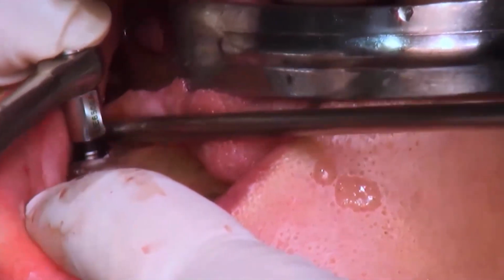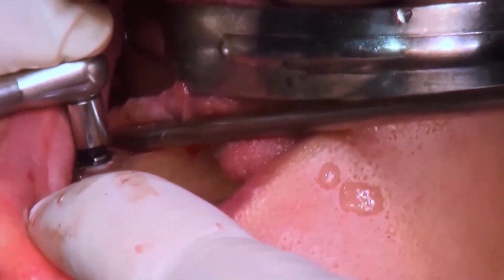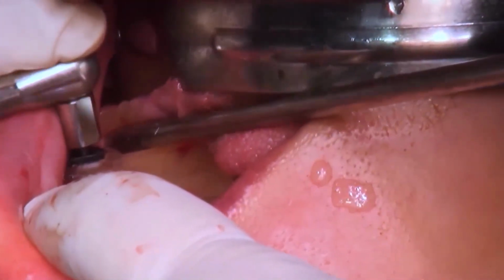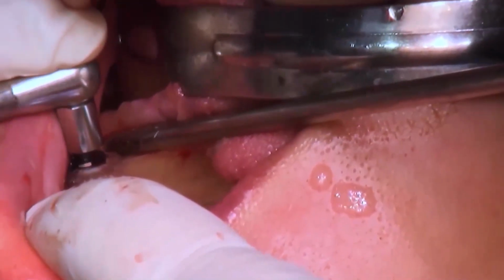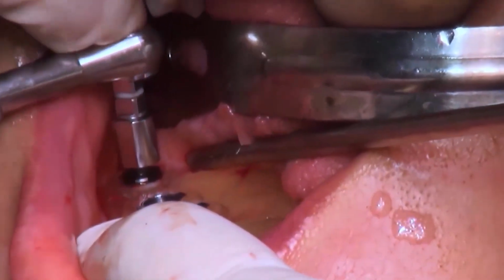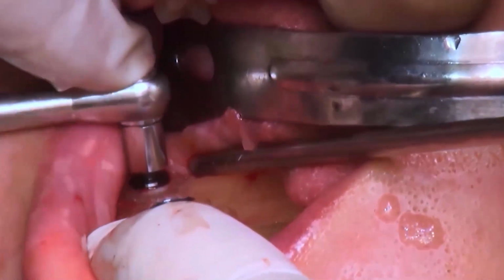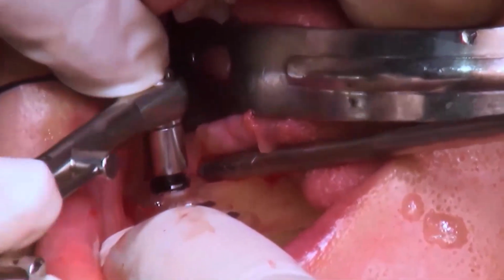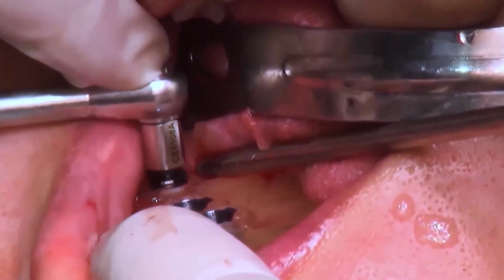I got a severe torque. The severe torque was released by counter-rotating the implant connector.